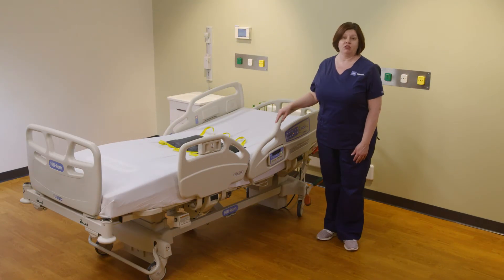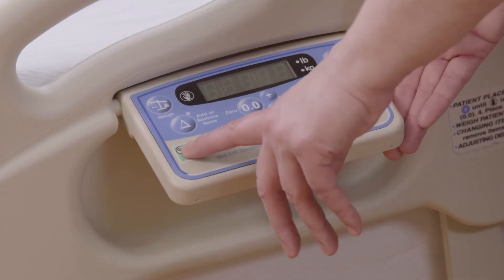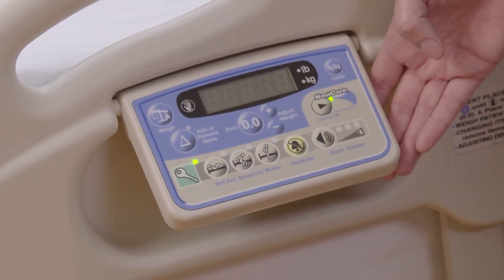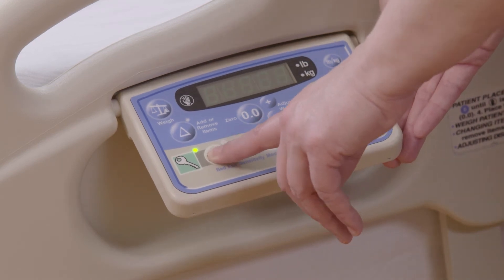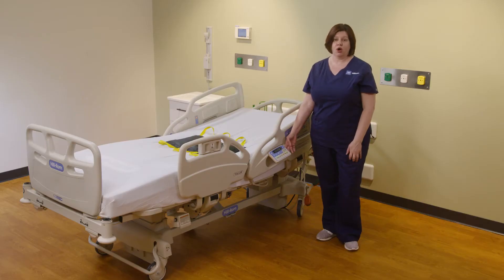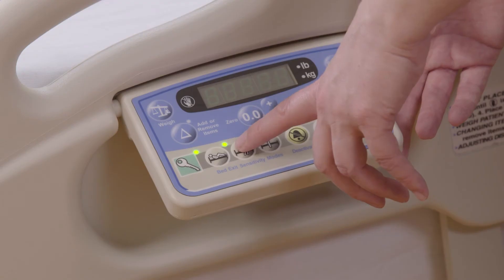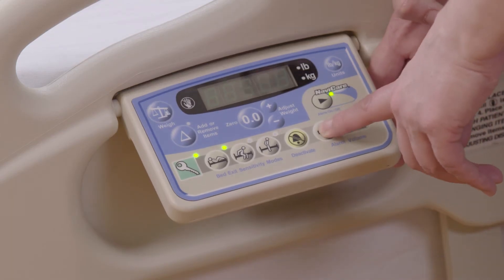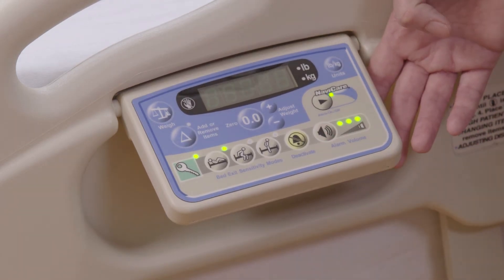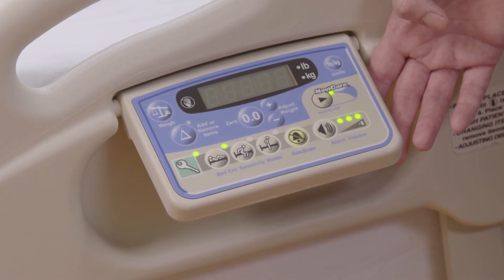Now I'm going to set an alarm for a patient who has been deemed a high falls risk. Simply engage your key on the scale pod and select the most sensitive setting. You will hear one chirp indicating the bed exit is set, and the light next to that icon will be illuminated. Additionally, if you would like to increase the volume of the alarm, you can push the volume button to increase the local alarm volume.